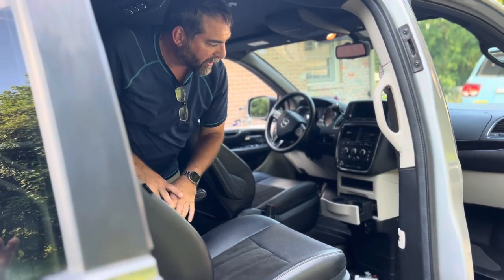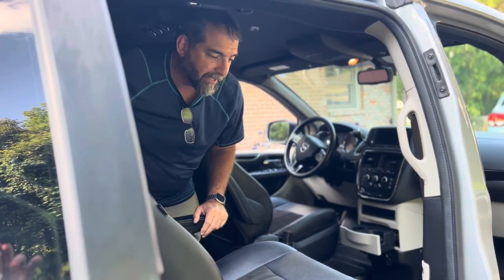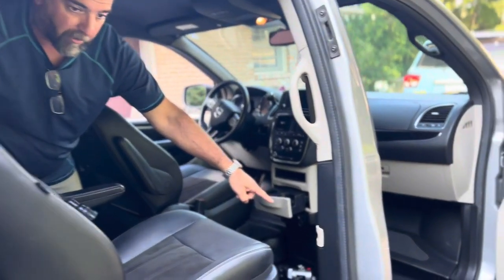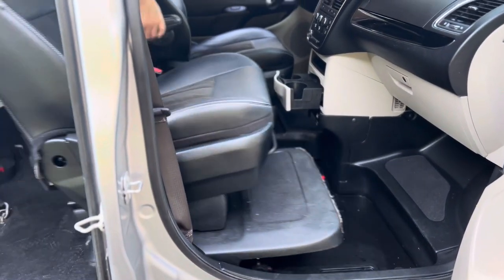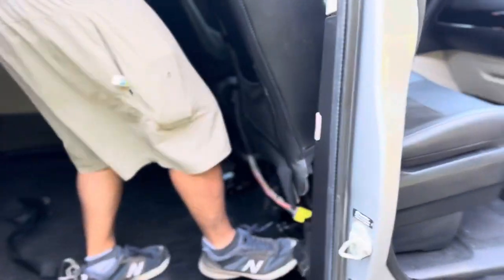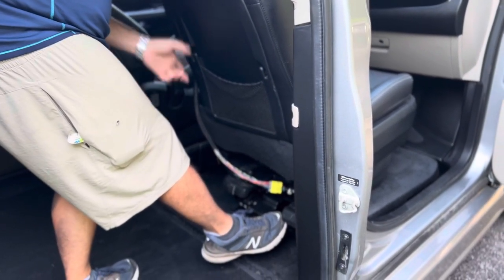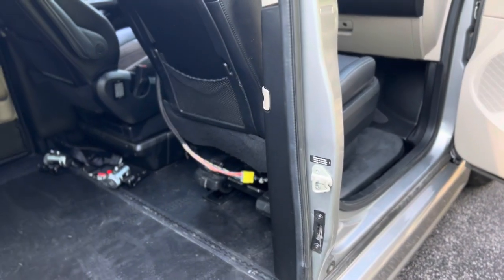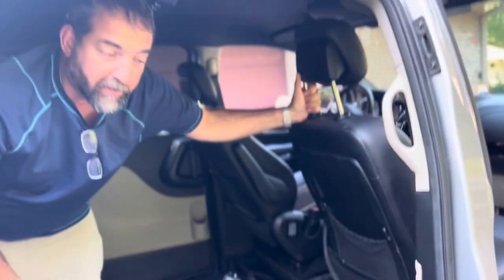Once the seat is removed, your wheelchair passenger can sit right up front in the passenger seat. To put the seat back, should you need to do that, you align the seat with the rails — you can see there are connections to the rails there. Once you have them inside the rails, you step on the paddle and it snaps into place. Make sure you give it a good tug to confirm it is secured.